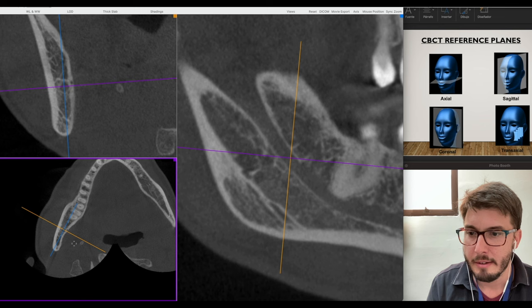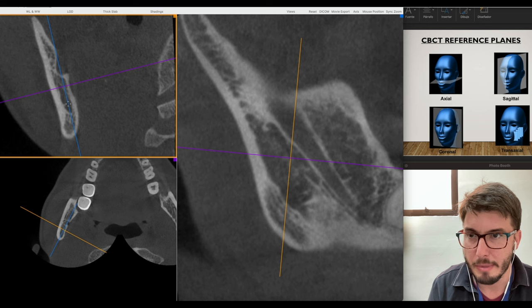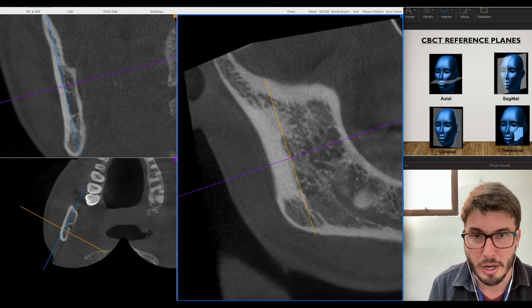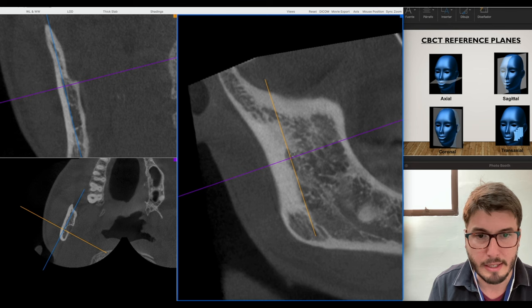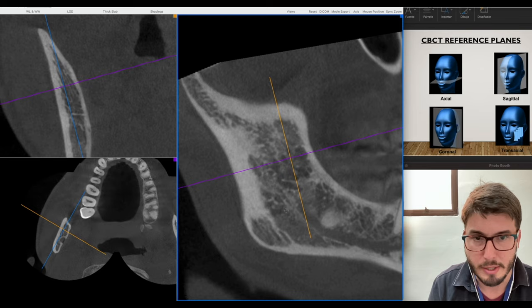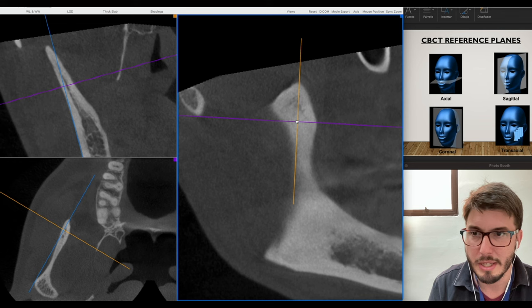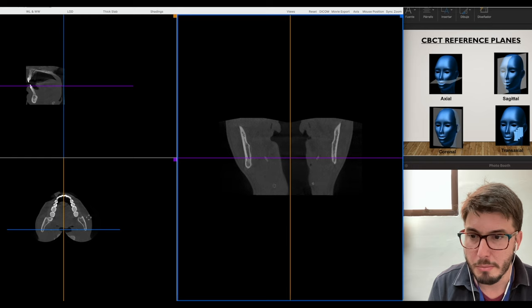Moving to the ramus of the mandible — I make all planes parallel to the ramus. The mandibular angle is now visible. I can also see the area of the condyle reachable in this scan and the coronoid process, which is positioned a little more anteriorly.